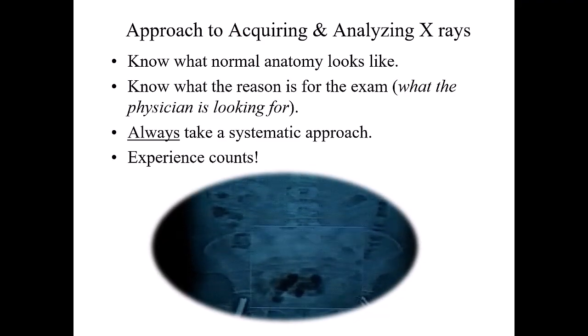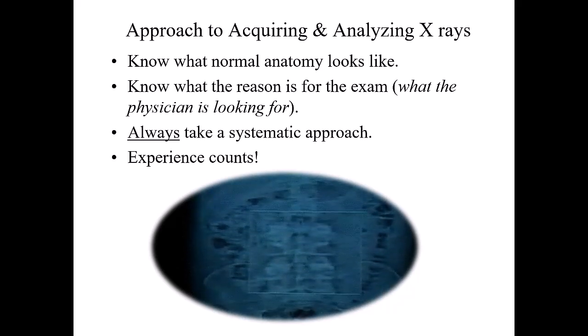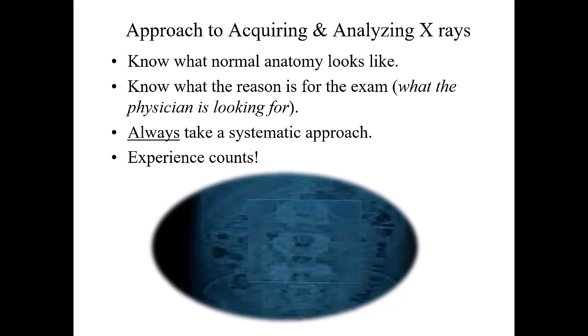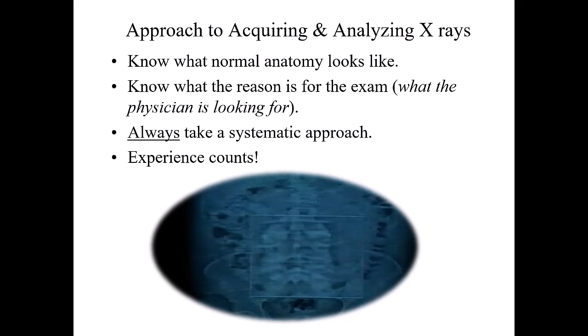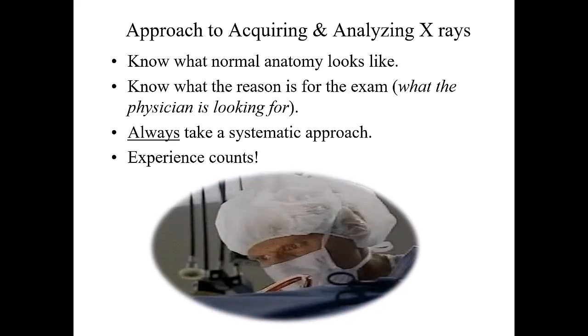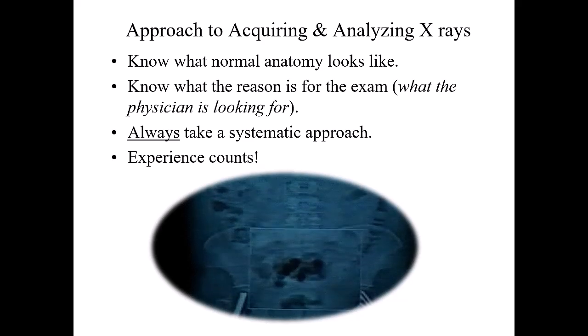Trauma imaging differs from routine diagnostic imaging. The radiographer must understand normal anatomy and pathology and what is normal and what appears to be abnormal in the image.